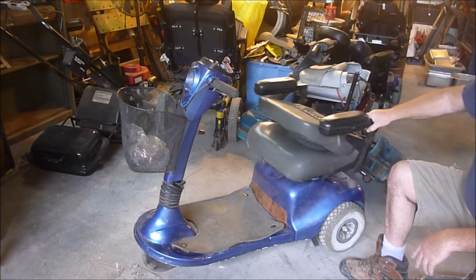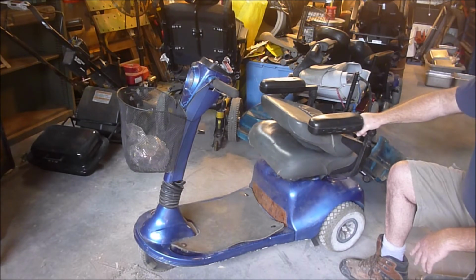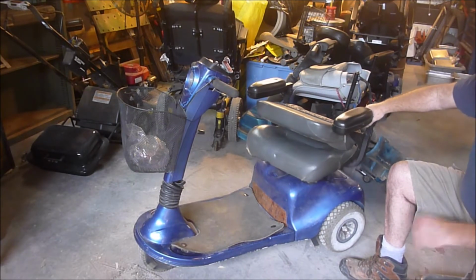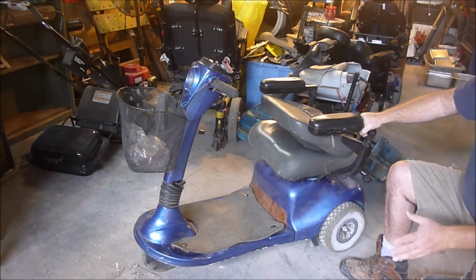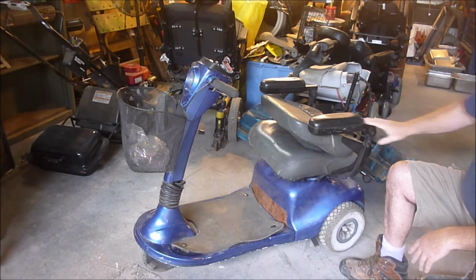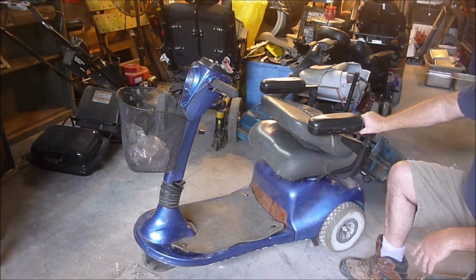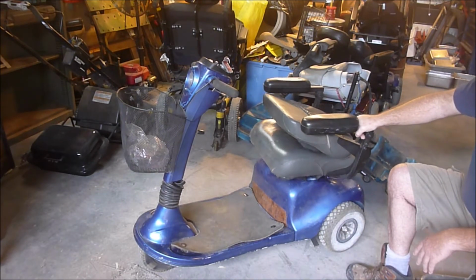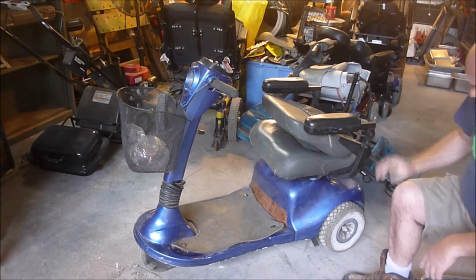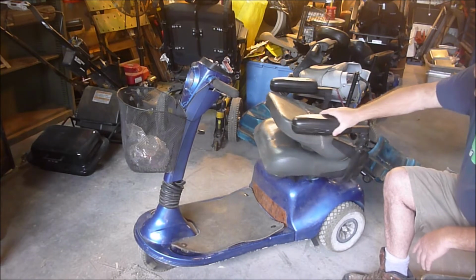I bought this actually when we took a trip to New York, and this thing went off edges because a lot of the older areas in New York don't have wheelchair capable sidewalks. So I would scoot this thing right off the sidewalk. I think that's where I first started bending the axles, actually. But it did pretty well, and then I went down a dirt road that was full of big rocks and came down and bent one of the axles pretty bad. It still runs and drives, does pretty well.